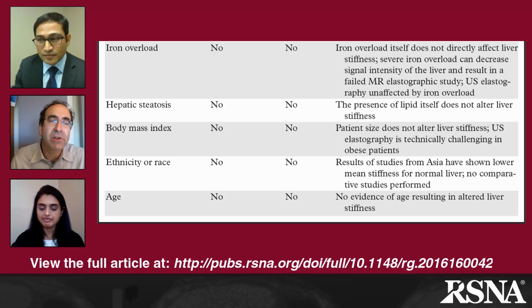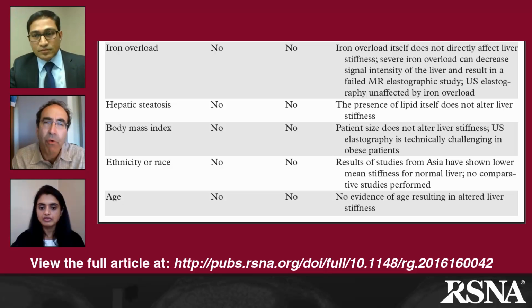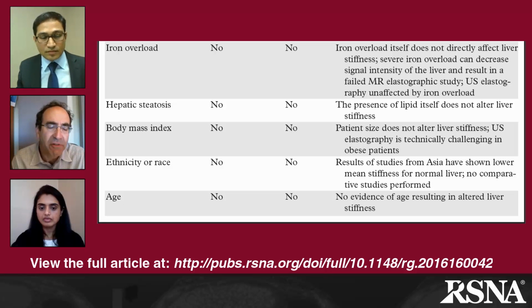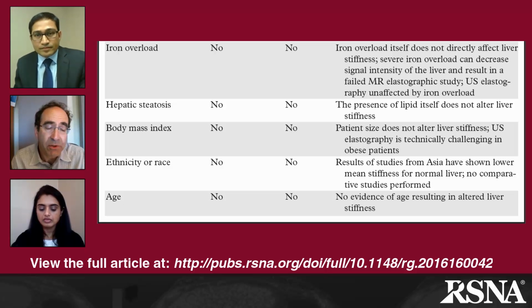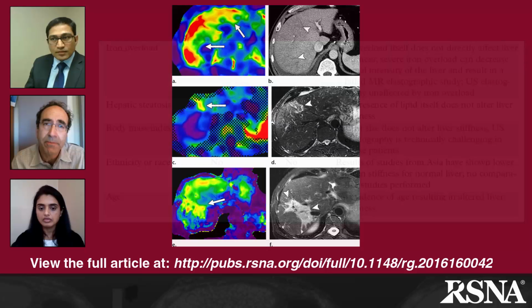Great, thank you so much for that. Let me ask you one other follow-up question. Your paper provides a fairly detailed description of how to perform magnetic resonance elastography, and in particular how to interpret the resultant stiffness patterns and correlate these with the anatomic imaging. Can you take us through some clinical examples of patients as illustrated in figure 15 in your paper?